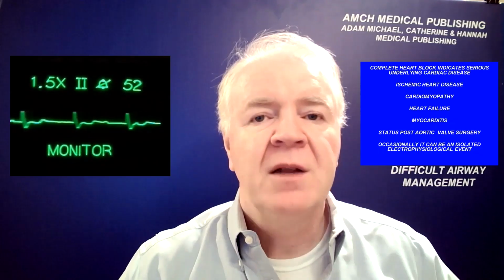The key to the diagnosis of this rhythm is to note that the P waves and the QRS complexes are completely unrelated to each other in timing. A useful trick is to take a strip of paper and mark the positions of all the P waves on this piece of paper. Then take a second strip of paper and mark the position of all the QRS complexes, and then attempt to superimpose one strip on the other to see if the P waves and the R waves bear a constant relationship to each other.